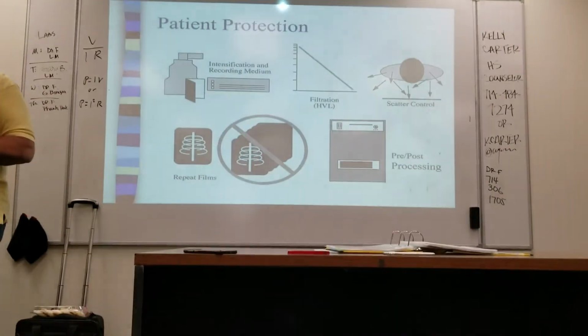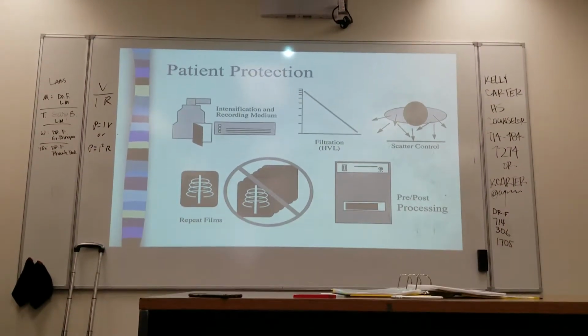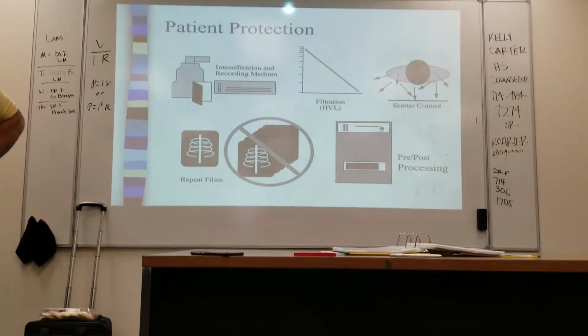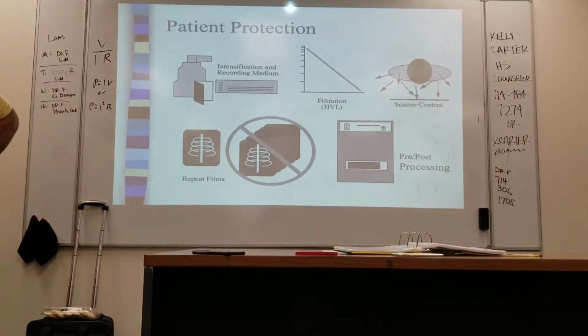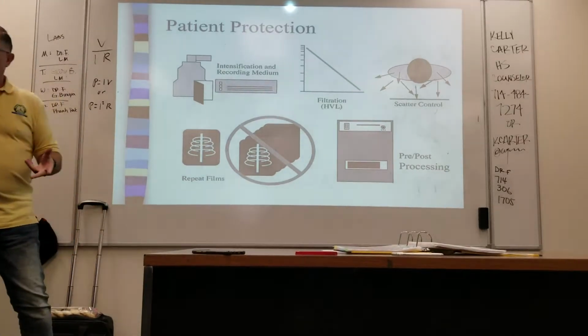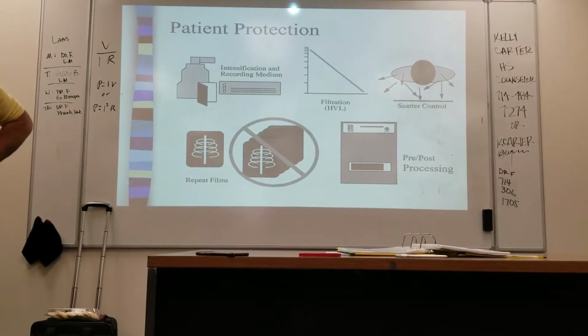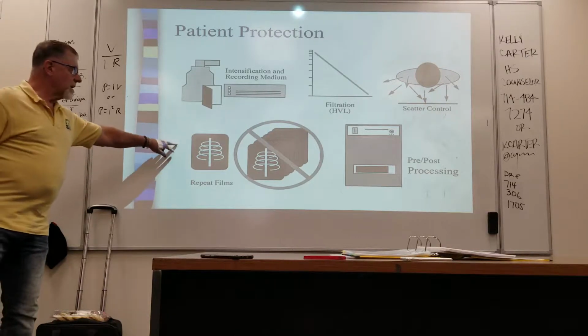Repeats are horrible. You do not want to do repeats. The problem with the digital age is unless there's somebody in the facility that's actually monitoring and capturing repeats, it's very easy for those to happen and nobody really knows that they occur, which is problematic. Repeats are important. I know you folks are judged on repeats. I'm not quite sure the method that they use for that because not all hospitals really have an automatic system for doing that.